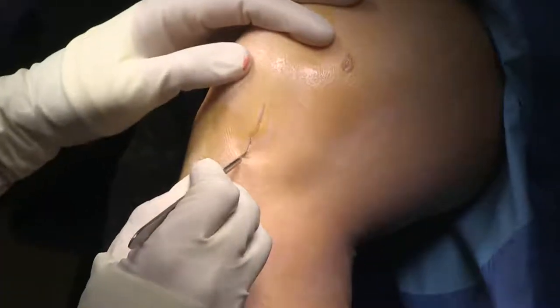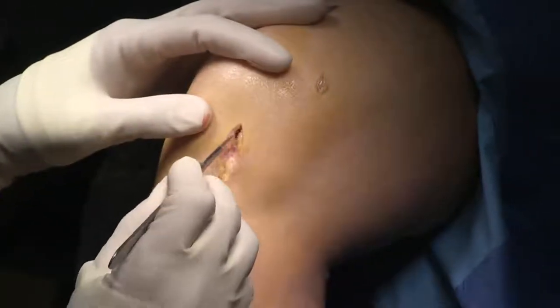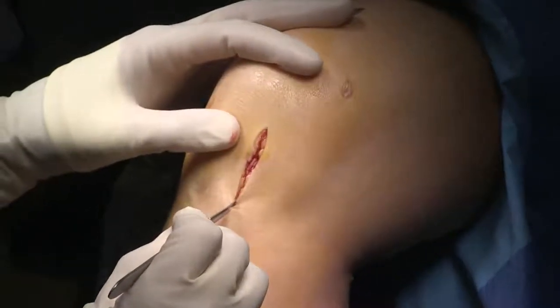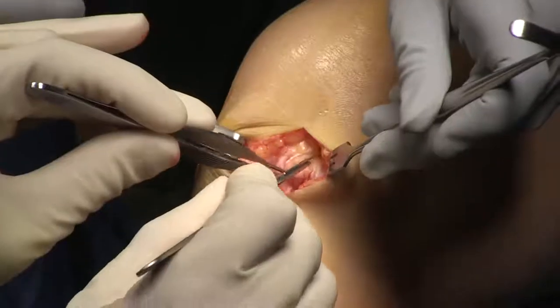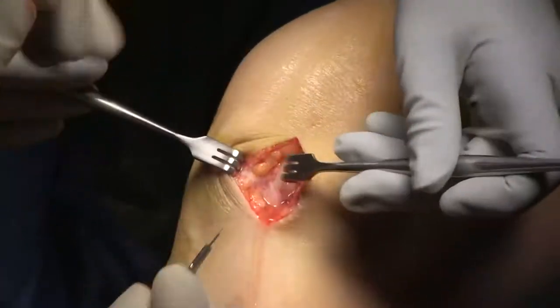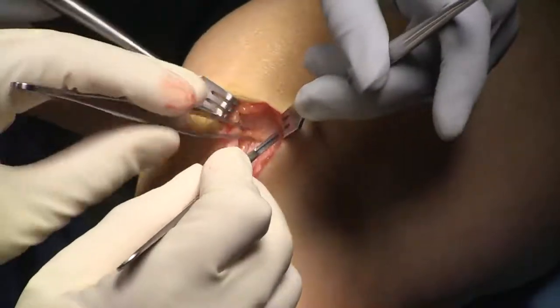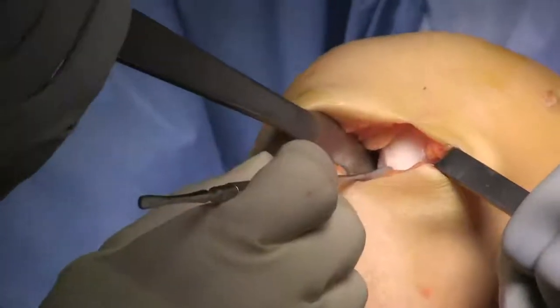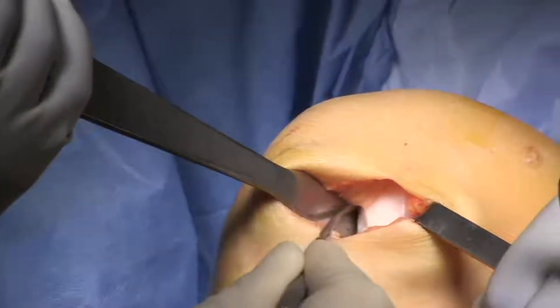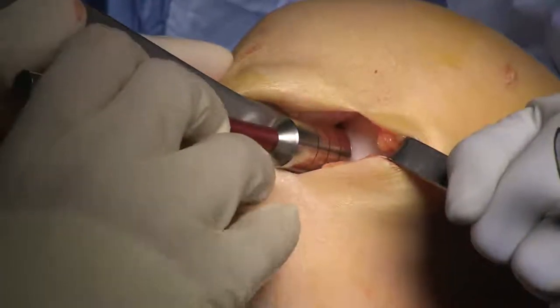Now we're extending our medial portal into a medial parapatellar arthrotomy — simply extend the portal, coming adjacent to the patella tendon. We use retractors so that we can see our arthrotomy being performed. Once the arthrotomy is performed, you can see we have a view of the femoral condyle. We'll put a retractor into the notch, typically something like a Hohmann, which will pull our patella and patella tendon. Here we're using sizers to size the lesion.